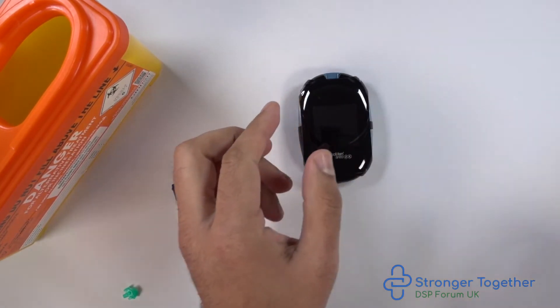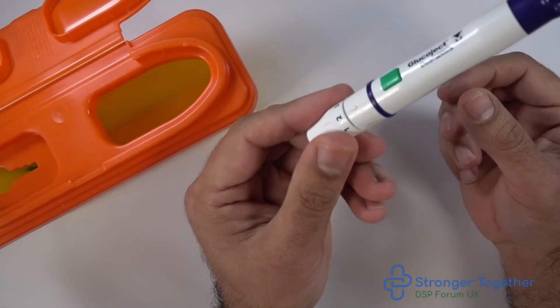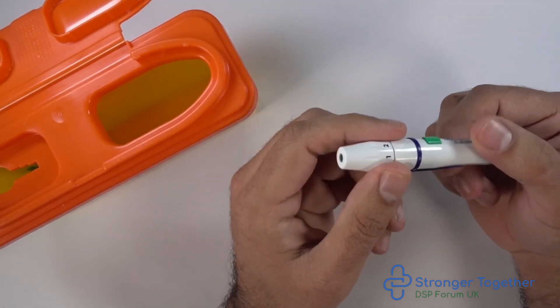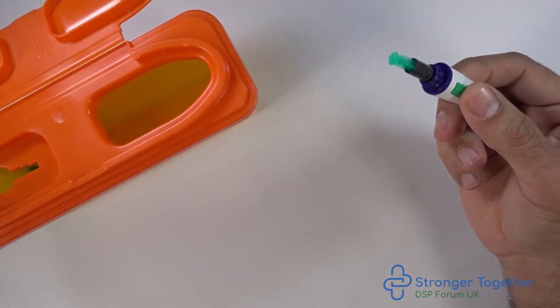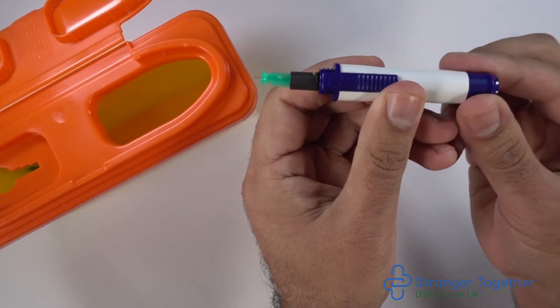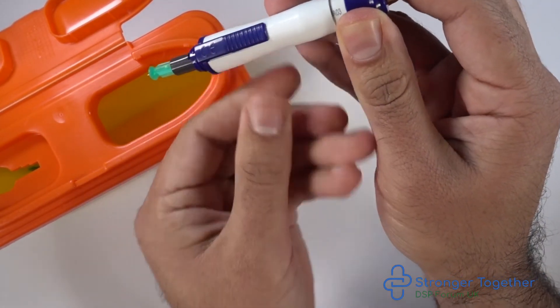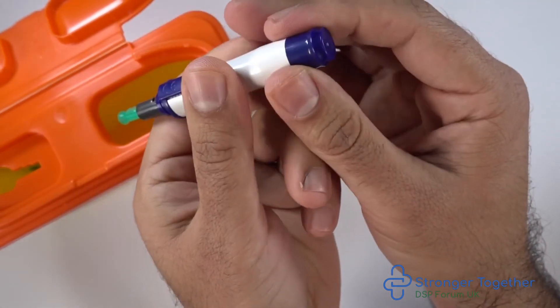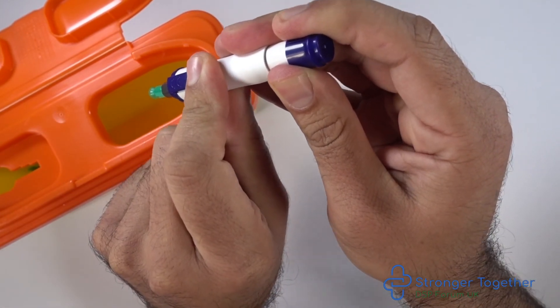Now we have finished, we can discard the test strip safely and discard the lancet from the lancing device. Unscrew the end of the device in an anti-clockwise direction — this exposes the lancet, so be careful of the needle. You push the blue slider on the side forward and pull back the plunger on the other end of the device in a simultaneous fashion, or hold back the plunger and push the blue slider forward as shown here, and this will discharge the lancet into your sharps box safely.